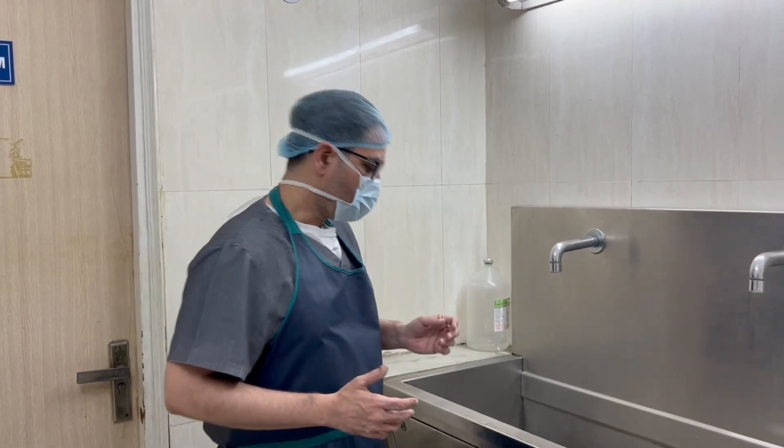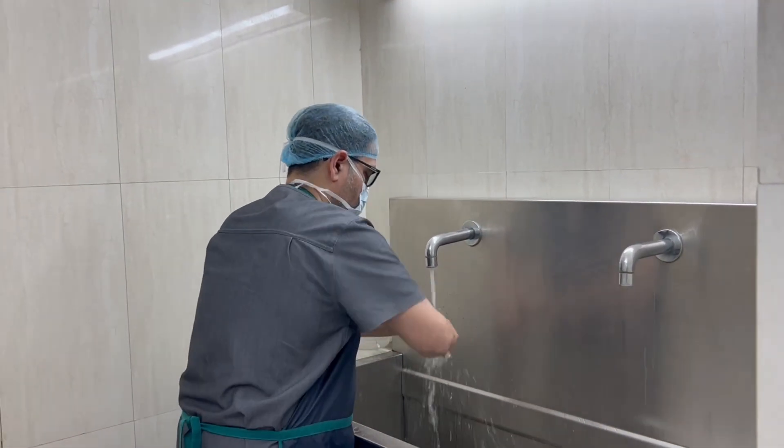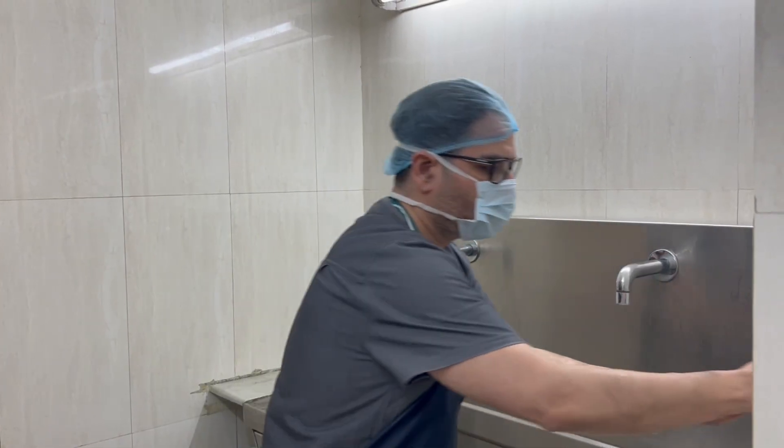So let's see their live video. First of all, let's wash our hands. We always wash our hands in running water. We scrub for 10 minutes.